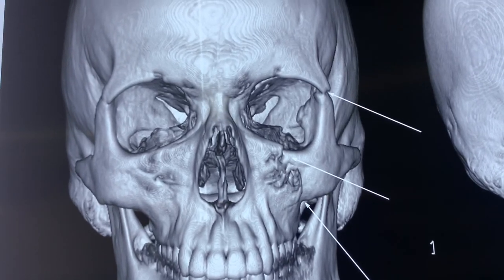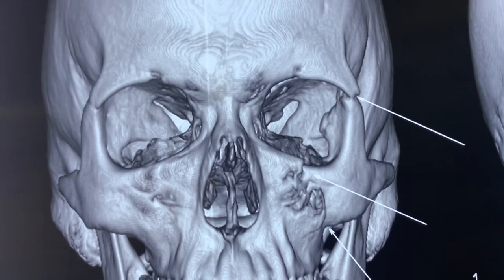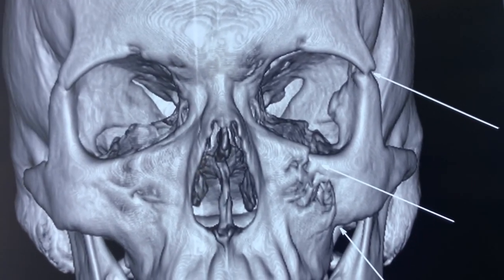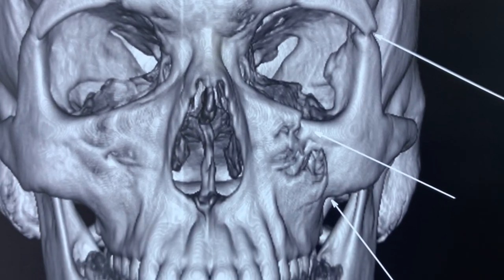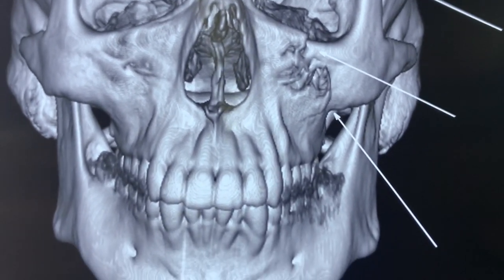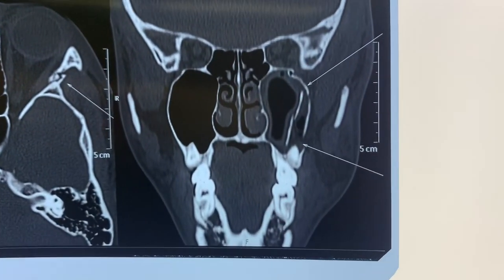Arrow shows the zygomaticoinfraorbital rim fracture. You can see that's also displaced inferomedially. There's a fracture extending across the orbital floor. It's coming through the infraorbital nerve and goes to the buttress there, ends there. It's displaced by about 5-6 millimeters at most.